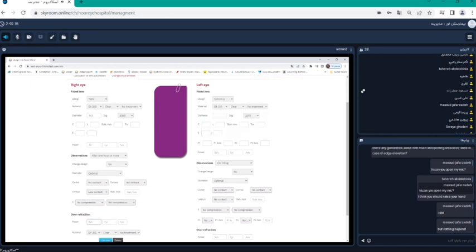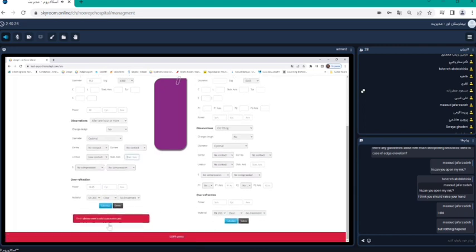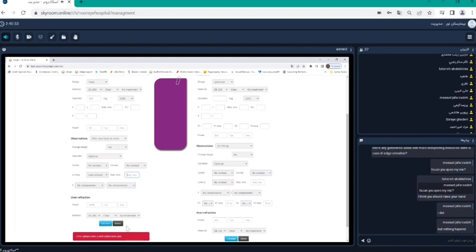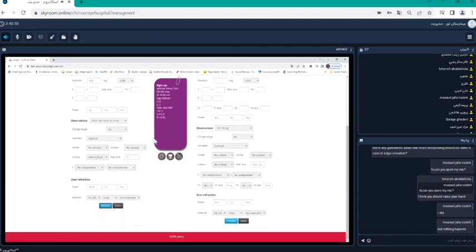We had another refraction of plus 0.25. And when you do that, you say calculate. Whoa, it says error. Please enter valid stabilization axis. Oh yes, we have forgotten the stabilization axis. This is what I told you earlier. And you noticed what the stabilization axis was. It was 0. So once again, if you have forgotten something, it will help you. Now I say calculate, and you can see it will automatically calculate the right lens to order.